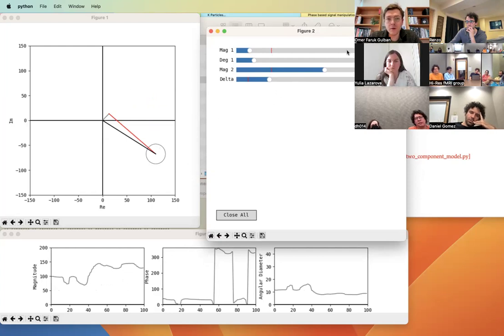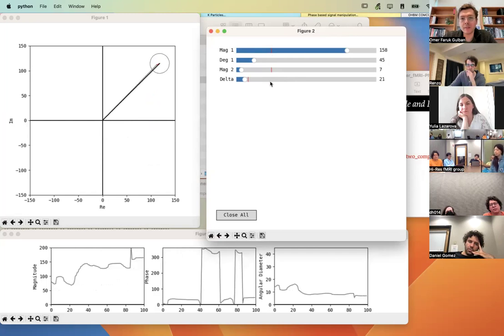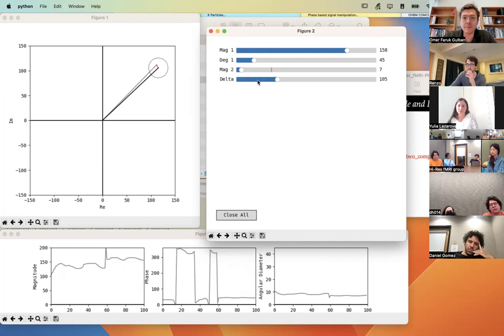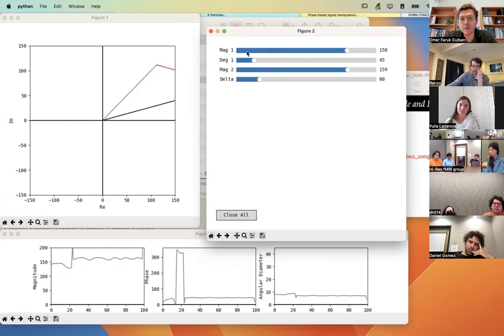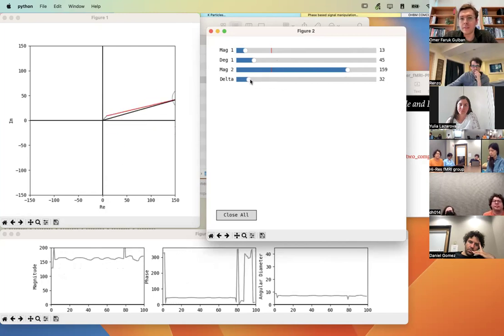However, now imagine the opposite situation where you have a lot of gray and little red, okay? Now let's induce the same 90-degree change in the difference between the blood and the gray matter voxel. As a result, the phase that you can measure, the degree of this black vector, doesn't change as much. It's just changing a couple of degrees here, whereas in the other way around, it changes massively. So that's the whole story, actually.